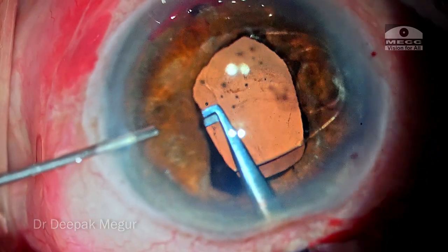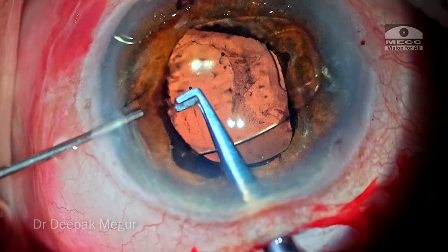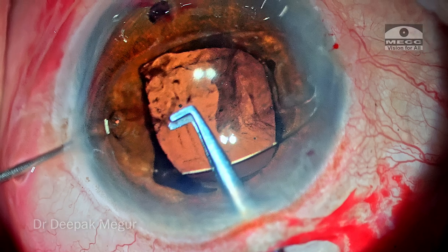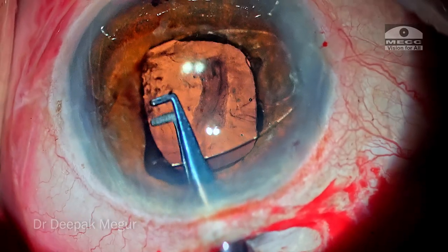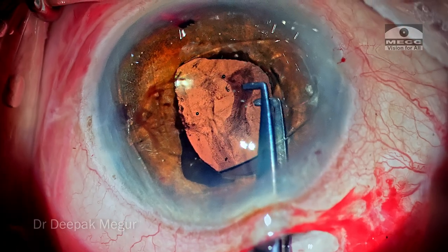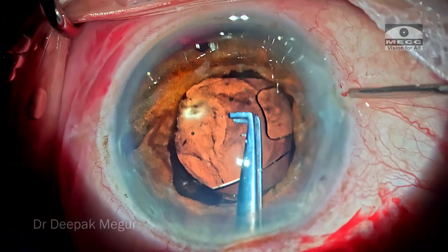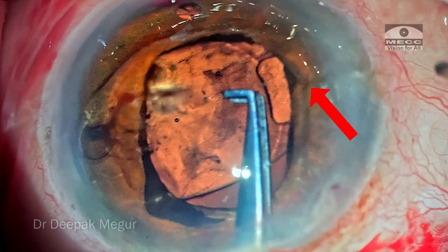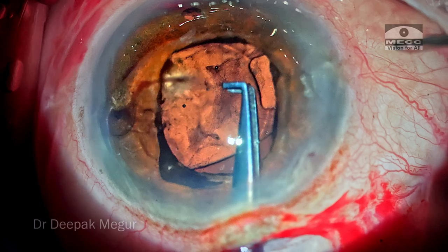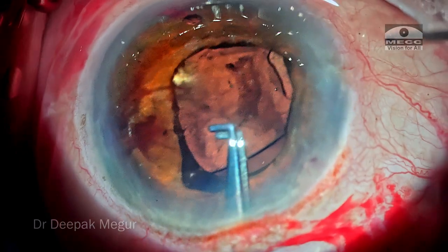The lens is pushed up and the cannula goes down, and we can see the puckering of the iris. I push the iris one more time and I'm pretty certain that the enclavation is pretty good. I can see the haptic jetting across the iris tissue. The iris stroma is probably atrophic and you can see the haptic coming across, so it's unlikely that this is ever going to get disengaged. The hands are switched and it's time to enclave the other haptic. The lens is stabilized with the forceps, the haptics pushing against the iris, and the 26G cannula pushes the iris backward. A small pucker appears on the anterior surface, and the lens is moved sideways to confirm that the iris also moves along with it. This is a confirmatory sign that the notches are well and truly holding on to the iris stroma.